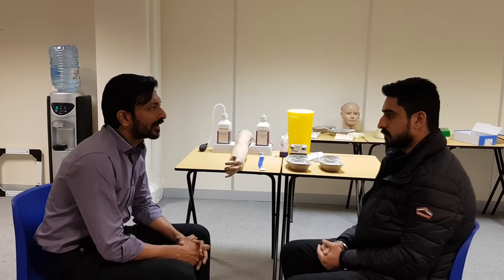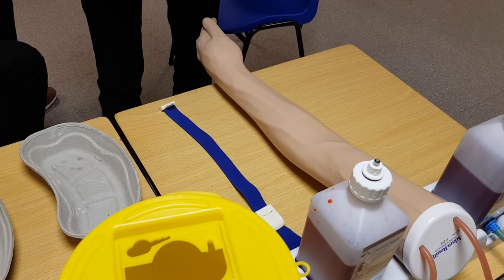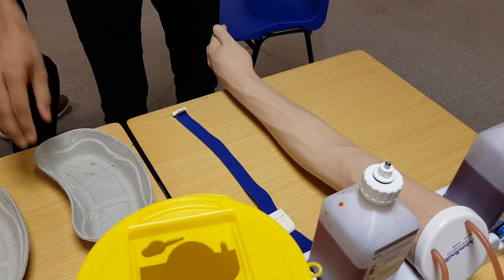Now I'm going to put one thin plastic tube into one of the veins in your forearm. It will feel like a sharp scratch and I'll be as gentle and as quick as possible. I may have to repeat the procedure if I fail on my first attempt. Do you have any arm preference or vein preference? May I proceed? Yes, okay, thank you. Examiner, where is my clean area? Thank you.